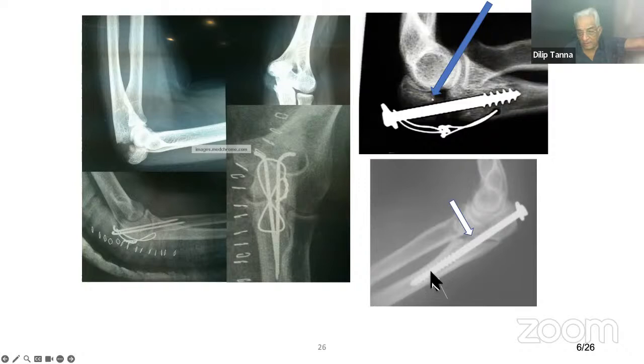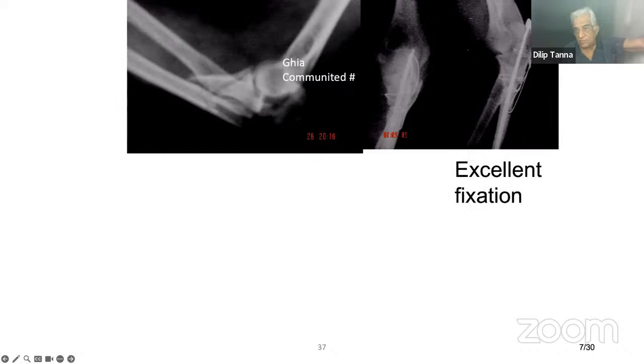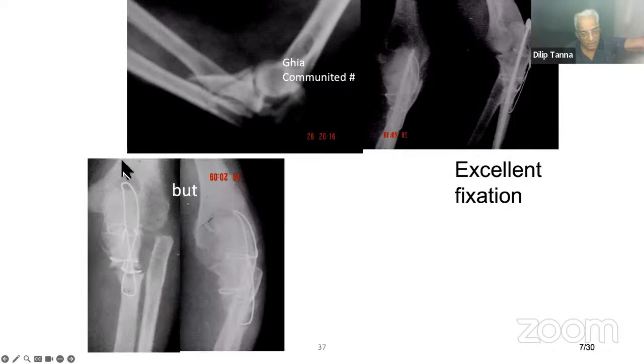Now, here was the patient, comminuted fracture of the olecranon, and the surgeon did this: intramedullary wire and a tension band and cerclage wire. Excellent, excellent fixation, excellent reconstruction of the olecranon was done. But they were intramedullary wires. And so in due course of time, those intramedullary wires came out. When they came out, the whole thing became completely unstable. And this is what it came to me ultimately.